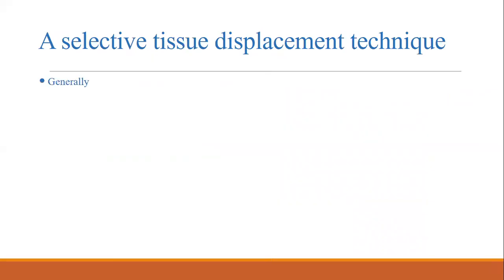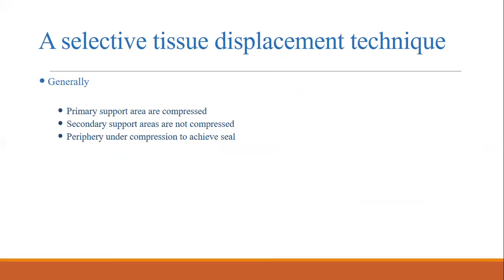Selective tissue displacement technique، بس تفهموا الكونسبت تبعها. Primary supporting area is compressed and secondary supporting areas are not compressed. Periphery under compression to achieve seal. طبعا يعني رح نفهم شو مبدأ السيل اللي رح يصير عندي بالدنشر and how we will achieve retention in complete denture.